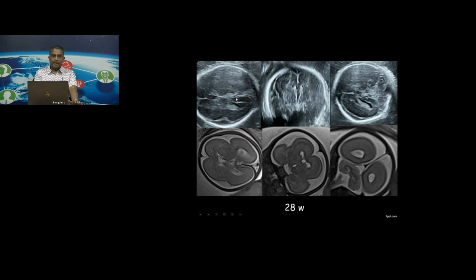One, I look at the parieto-occipital sulcus region, and I find that there's hardly any parieto-occipital sulcus, right? Now, I look at the lateral fissure or the sylvian fissure region, and I realize that it's absolutely shallow. You can recognize that both on ultrasound as also the MRI, which was done post-ultrasound for correlation of the ultrasound findings. On the axial image, again, the CSP looks a tad narrower than what you expect it to be.